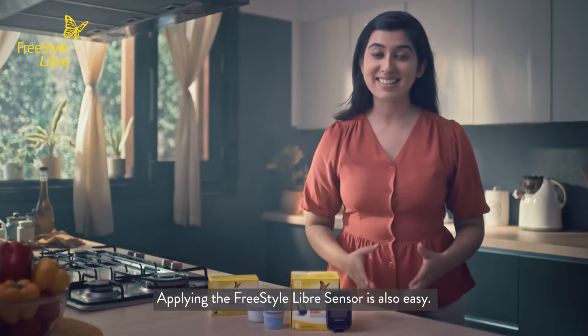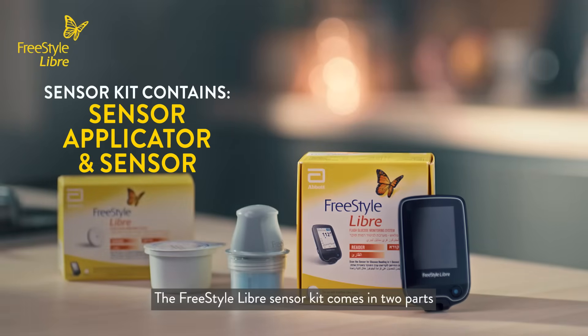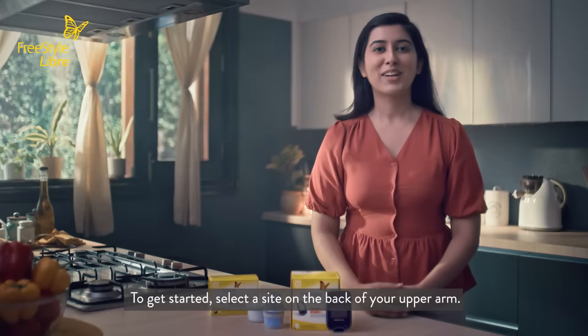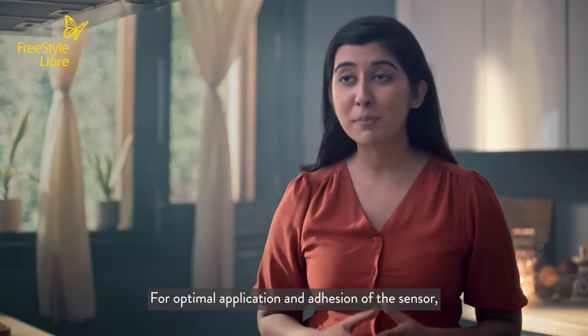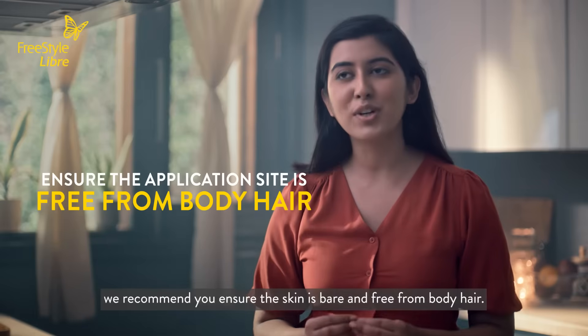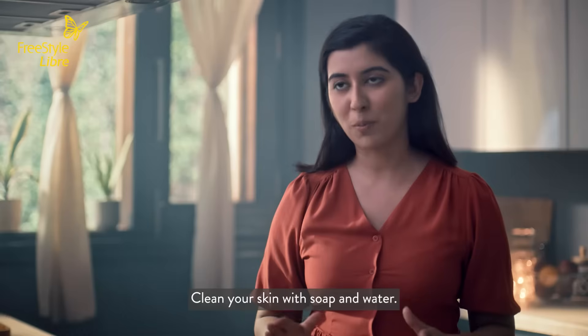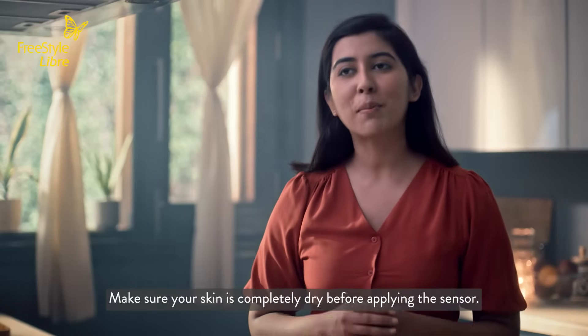Applying the Freestyle Libre sensor is also easy. The Freestyle Libre sensor kit comes in two parts: a sensor applicator and the sensor. To get started, select a site on the back of your upper arm. For optimal application and adhesion of the sensor, we recommend you ensure the skin is bare and free from body hair. Clean your skin with soap and water, and make sure your skin is completely dry before applying the sensor.